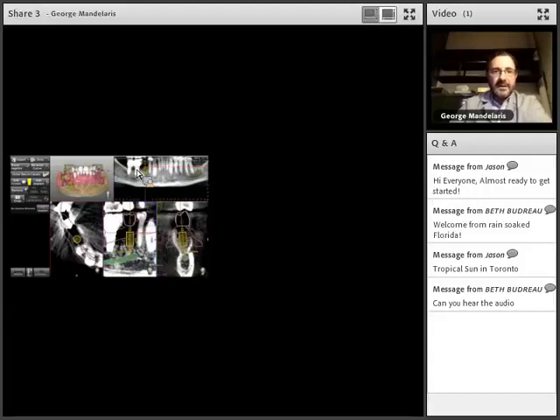From there, I'm going to trace out using the virtual tooth. I'm going to map out the mesiodistal, buccolingual, and most importantly, the vertical dimension of that digital diagnostic wax-up. That's what the prosthodontist or restorative dentist is telling me. That's the position they want the teeth in. That's what I'm going to plan from. So I map out that tooth using a virtual tooth, and then I plan and place the dental implant as you see here.